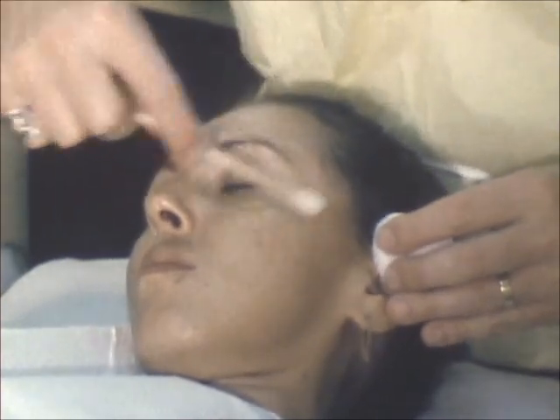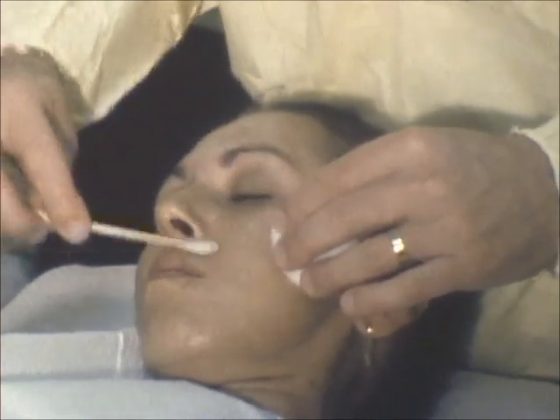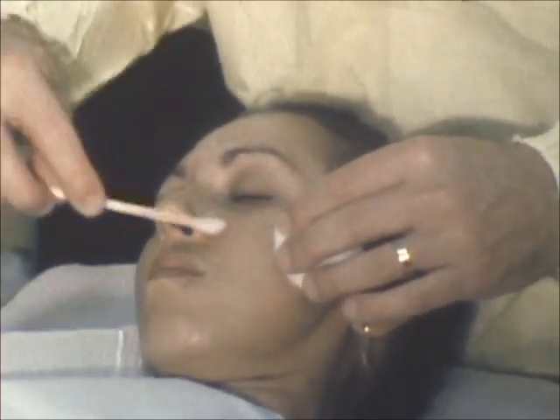Before the chemical peel, the skin is prepared with alcohol and acetone to defat the skin surface.